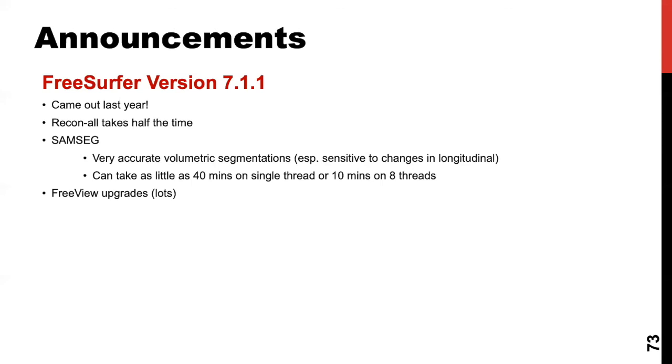Essentially, we have a newer version, FreeSurfer 7.1.1. It has more upgrades. It's super fast compared to 20 hours. And SAMSEG also has lots of improvements. So definitely feel free to check it out.